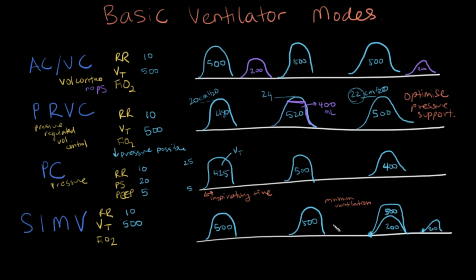And this allows them to develop spontaneous breathing. Just important to note there that if patients trigger their breath near the respirate or on the respirate, the ventilator will deliver the full breath. So I'll just make that clear, the ventilator delivers the full breath. But if they do it slightly afterwards or slightly before, then what they can do is what they get. And if they are not breathing by themselves, then this mode is essentially volume control.